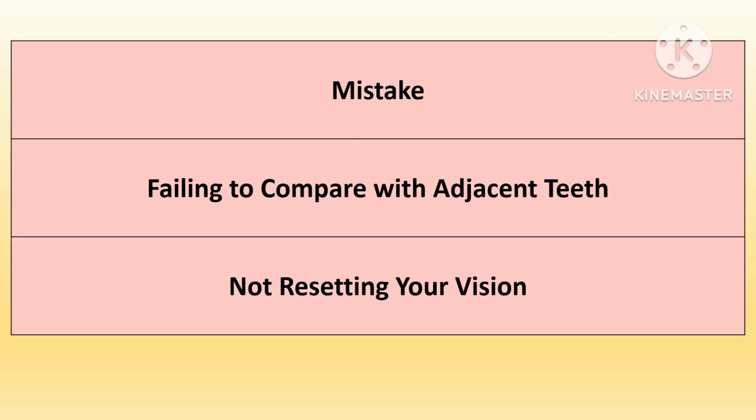Not comparing the selected shade to the adjacent teeth can lead to noticeable mismatch. Always double check the shade choice with the adjacent teeth to ensure that the restoration blends seamlessly with the rest of the dentition.